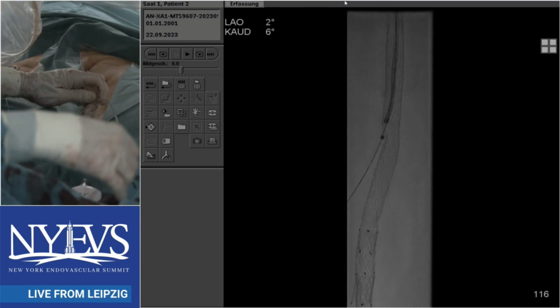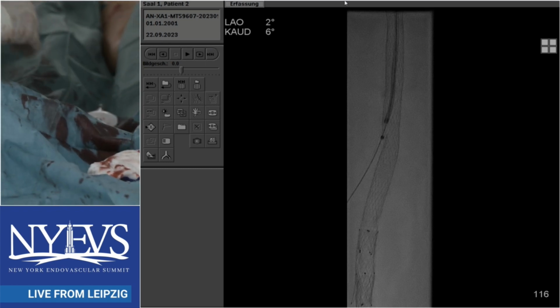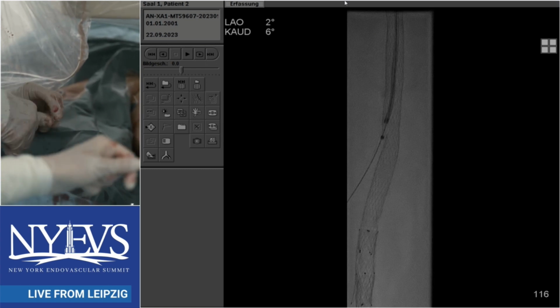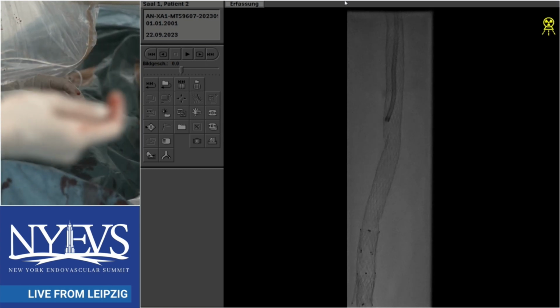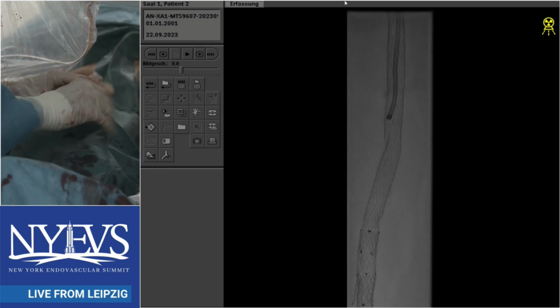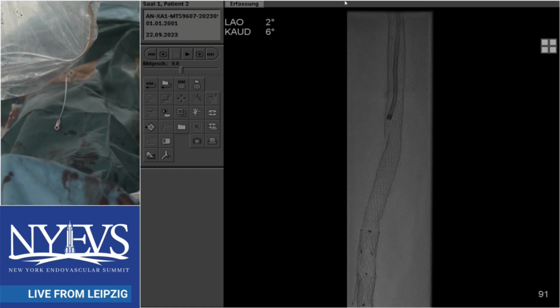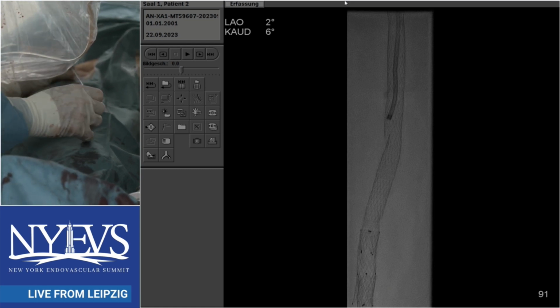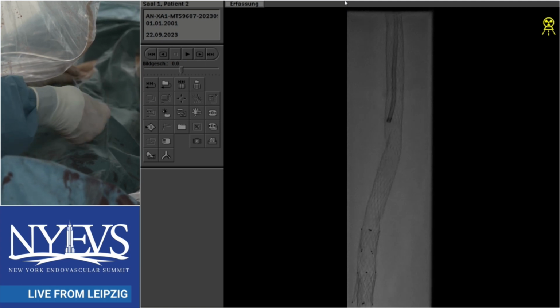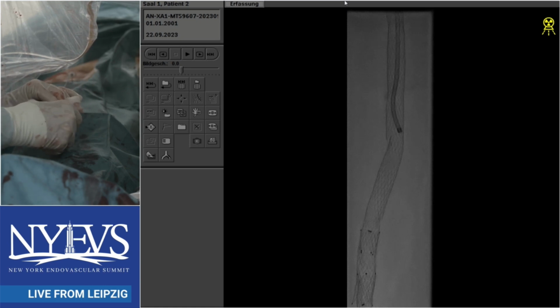And in your experience, could there be an opportunity to use a balloon from above to keep the guide wire in the center of the stent to avoid a retrograde access? Yeah, we have done this occasionally with mixed results. Sometimes it works, sometimes not. Potentially, I would prefer to take the GoBack catheter in, which could also sometimes be a little challenging.